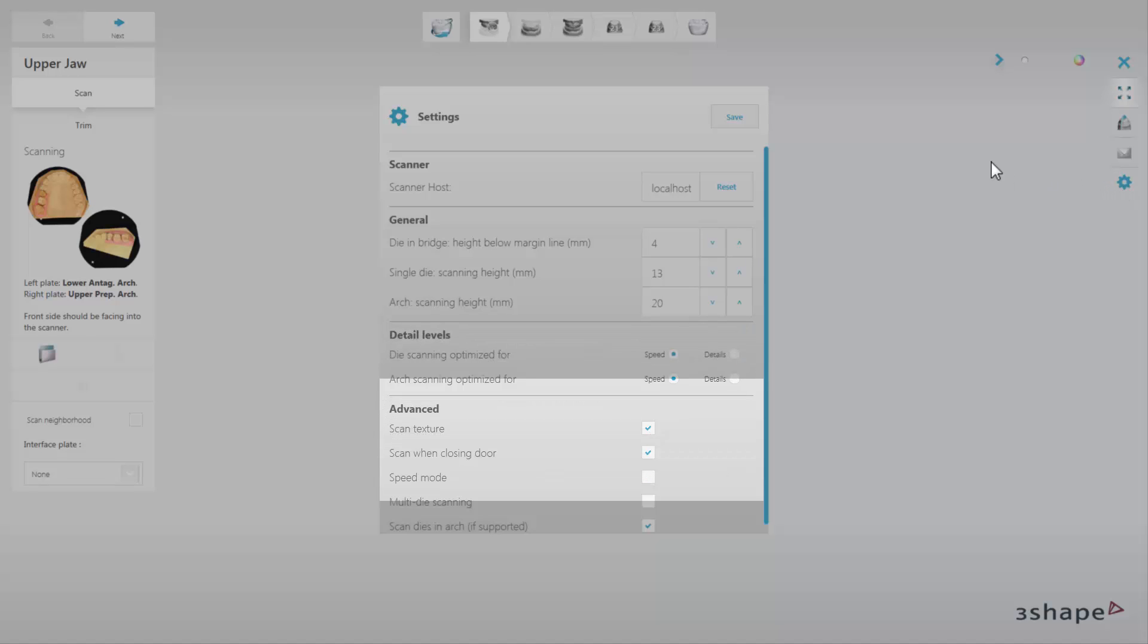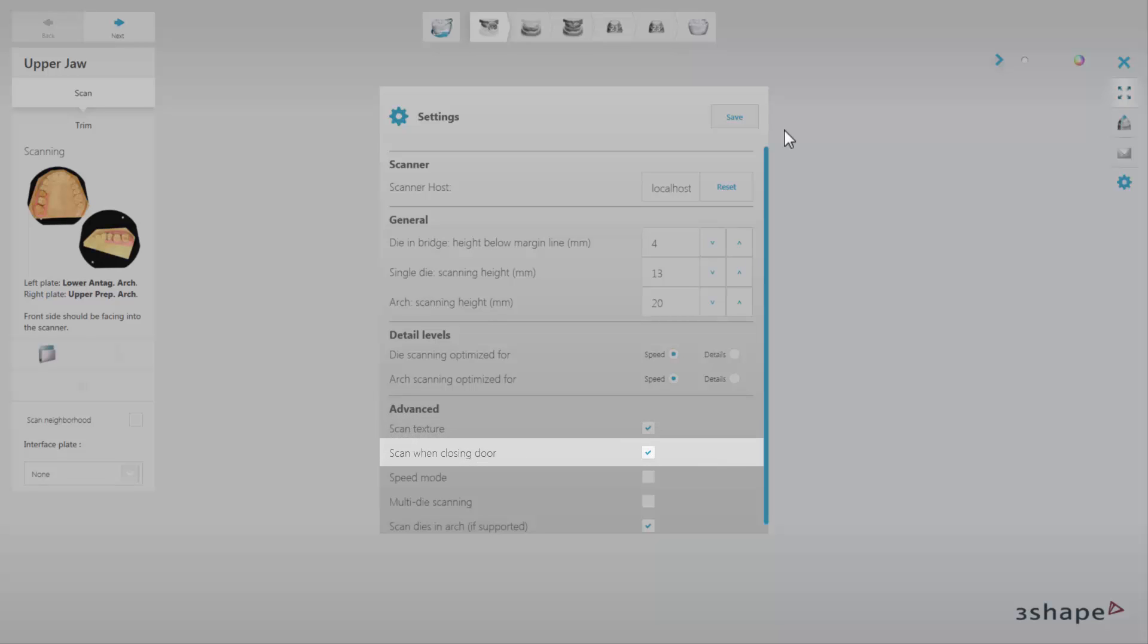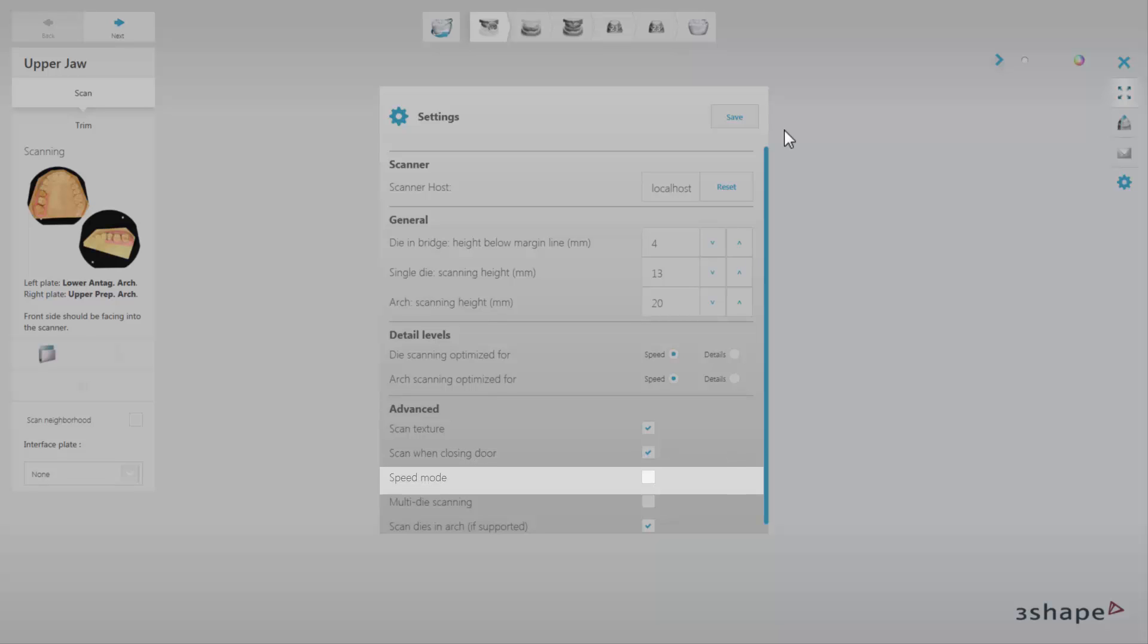Furthermore, in the Advanced settings you can choose Texture Scanning. This feature enables capturing hand-drawn markings penciled directly onto the physical models. Scan when closing door activates scanning when the user inserts an object into the scanner and closes the scanner door. Here you can also select Speed Mode to speed up the scanning process.